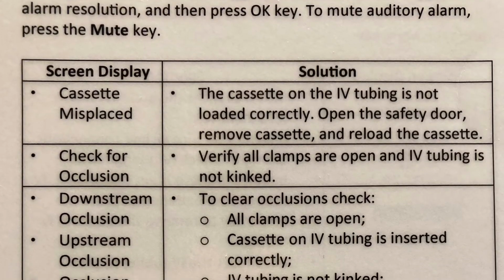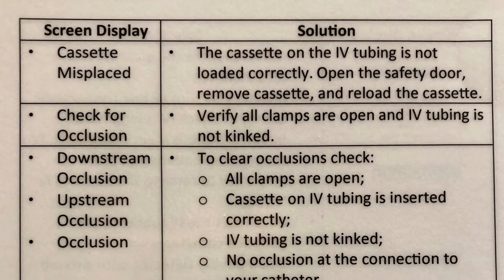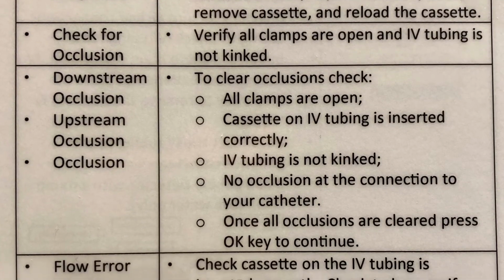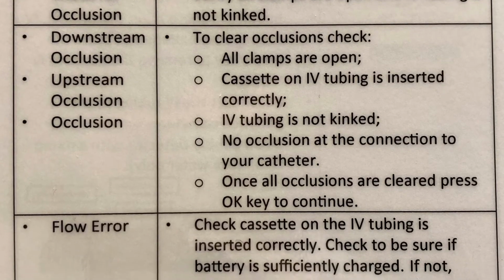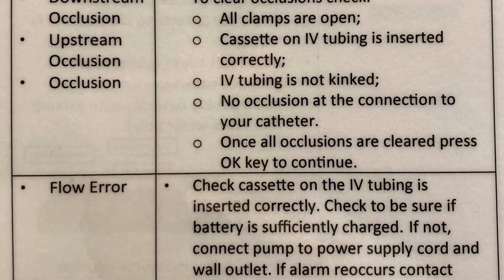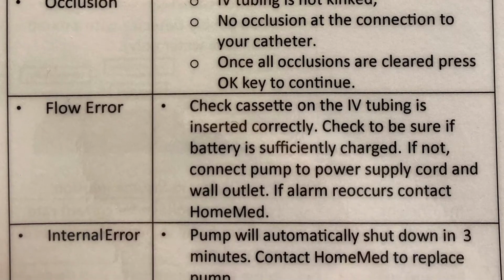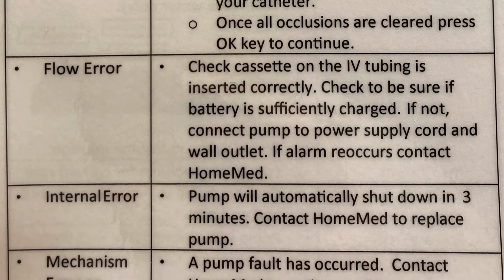Here are some common troubleshooting problems and their solutions. The most common one we see are occlusions. Usually it just means that something's kinked and you kind of have to move it around. Sometimes we just have to pop out the cassette and pop it back in on the pump, and that solves the problem.